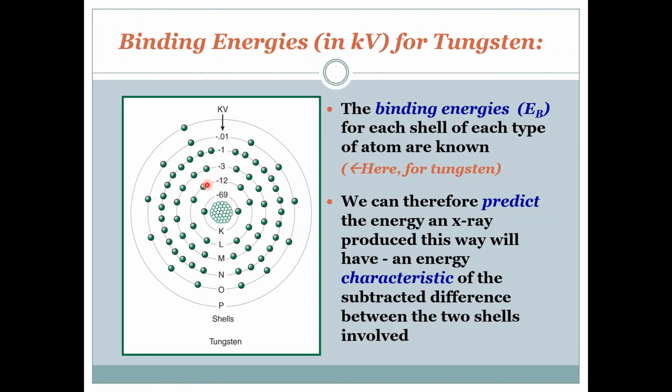And you may be asking, what happens to the L shell's space when it drops down to the K shell? Well, it's exactly what you think happens. The L shell opens up, and the M shell drops an electron into the L shell. Now the M shell has a vacancy, so the N shell drops an electron into the M shell, and so forth, and it cascades outward in what's called a characteristic cascade.